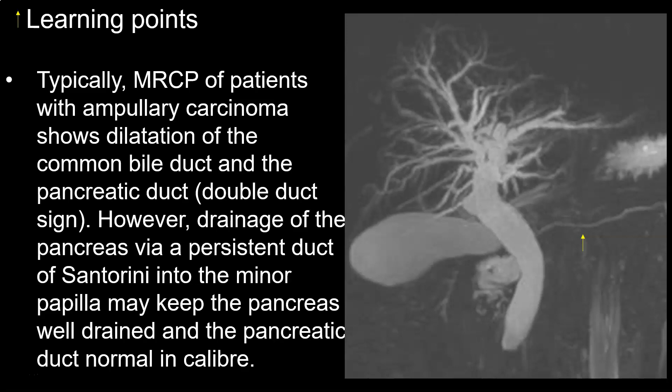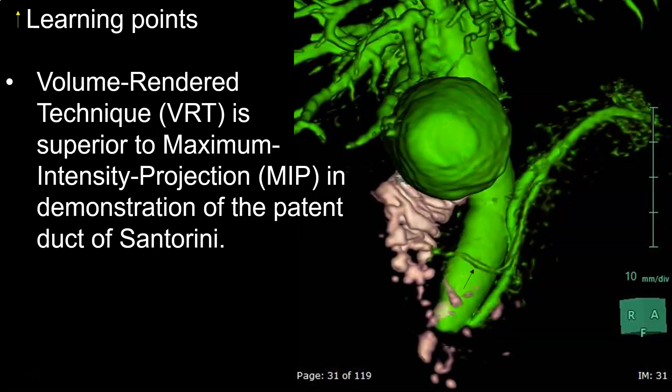Typically, MRCP of patients with ampullary carcinoma shows dilatation of the common bile duct and the pancreatic duct — the so-called double duct sign. However, drainage of the pancreas via a persistent duct of Santorini into the minor papilla may keep the pancreas well drained and the pancreatic duct normal in caliber. Volume rendered technique is superior to maximum intensity projection in demonstration of the patent duct of Santorini.